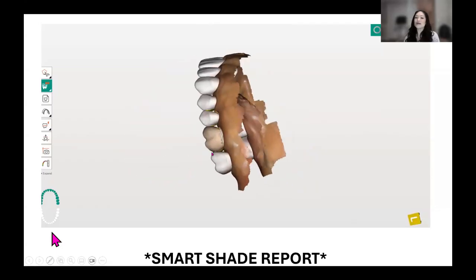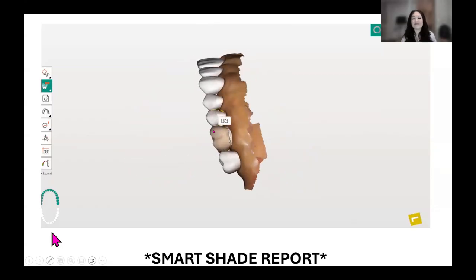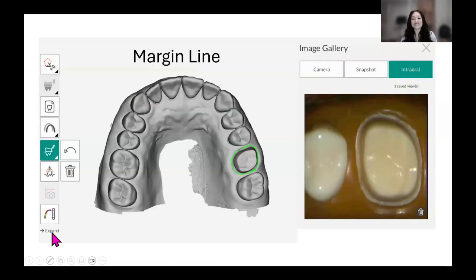And then as we go from the buccal, you can still see all the damage, the life that crown has lived in my bag, right? As part of my demo. But anyways, as you can see, as we move the cursor around, teeth are so many different shades. Oh boy, the margin line.